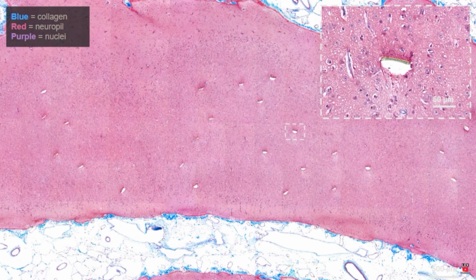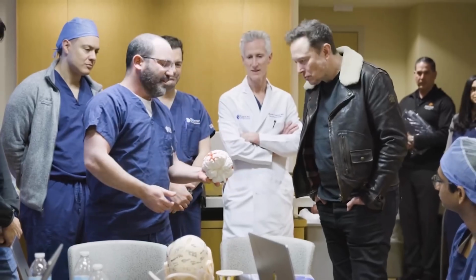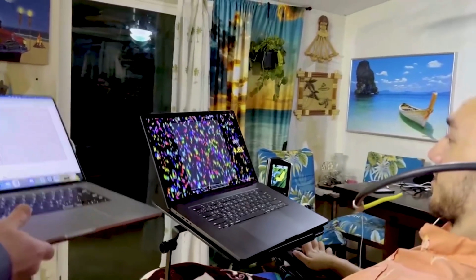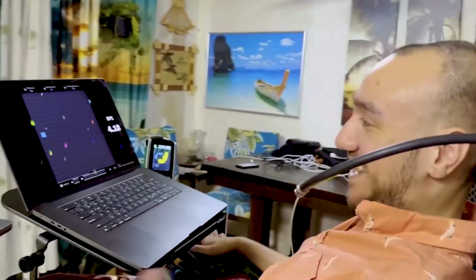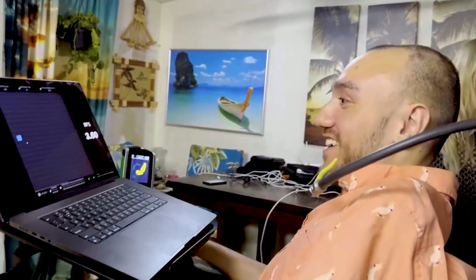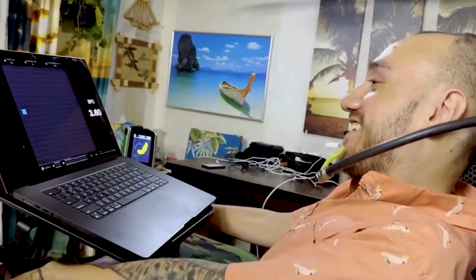And if someone asks how to remove or upgrade the chip, that's tied to safety too. Here's how. Either cut the threads and replace just the chip, closing the hole with a new chip or a plastic cap. Or, as they plan soon, make it not a single monolithic device, but two. The first part, threads, radio transmitter, chips, power source, under the dura mater.